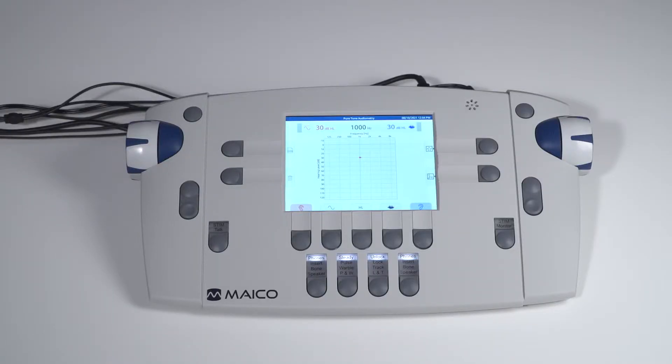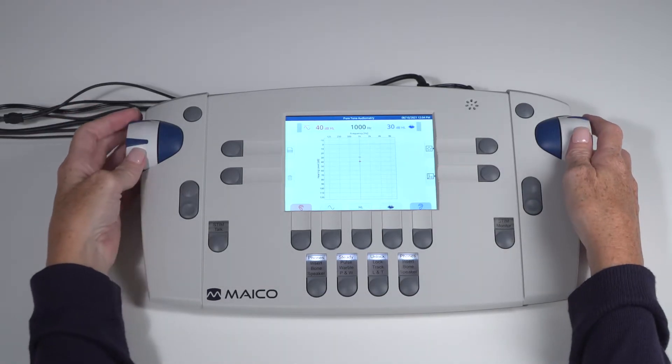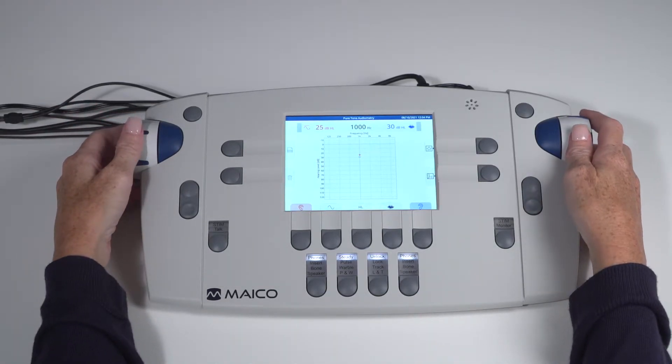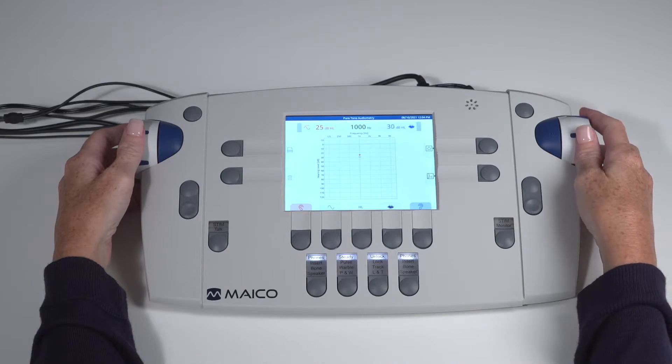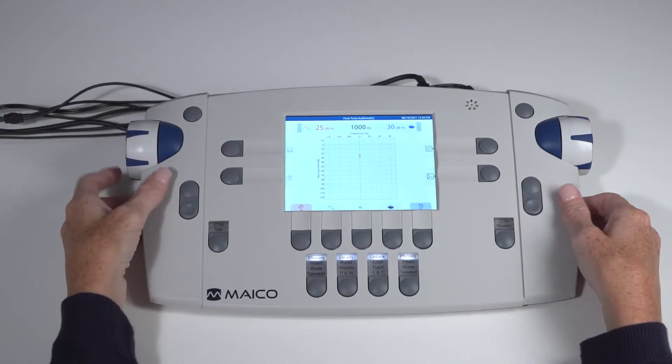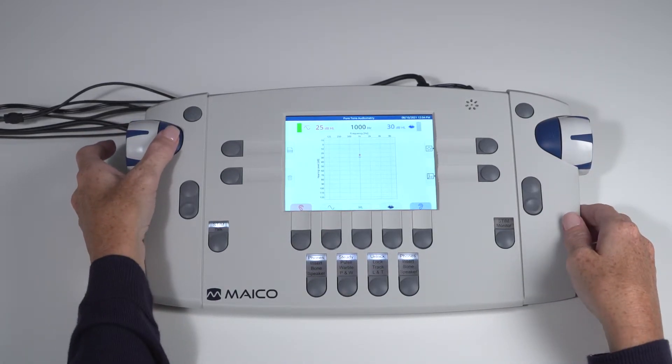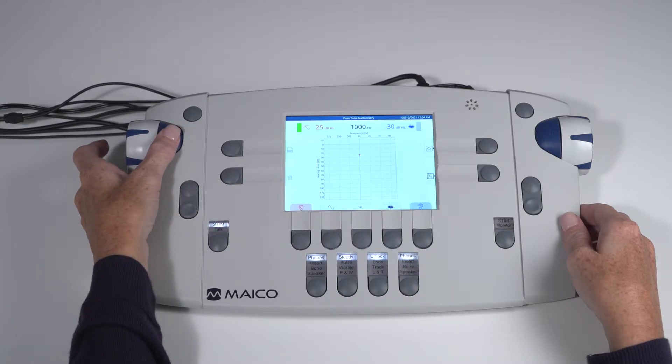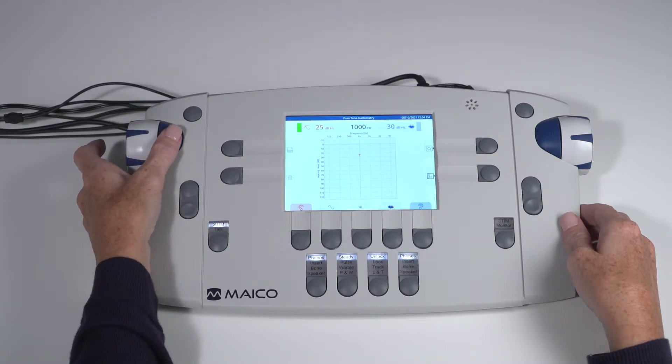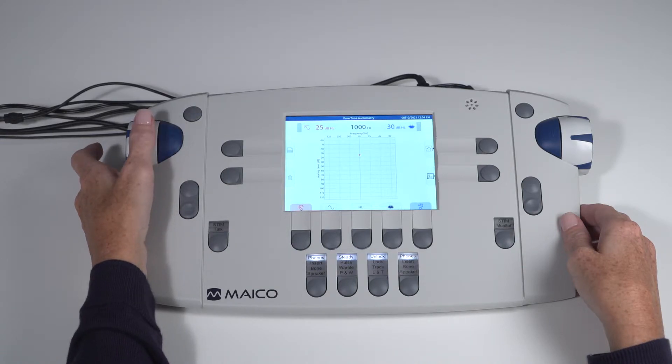Let's review the keys and dials on the front panel of the audiometer. The dials on the side change level for the signal on each channel. Change frequency using the plus or minus key and present the tone using the blue key next to the dial. You will see the LED stim light turn on as well as a stim light on the display turns green when the tone is presented.